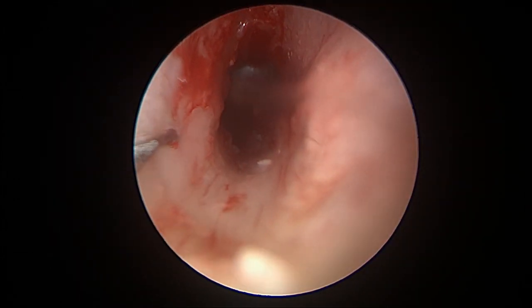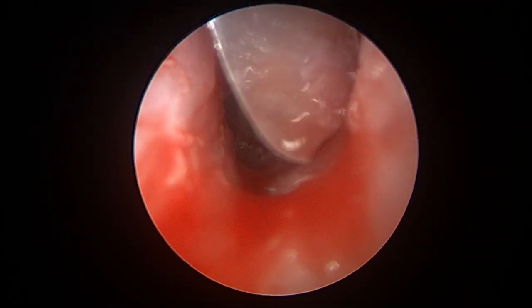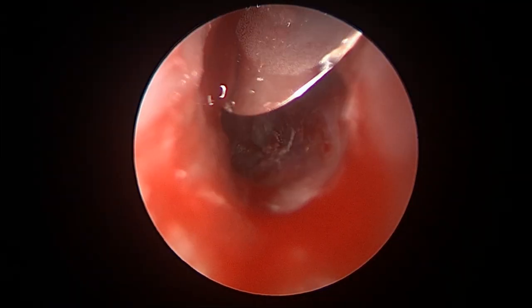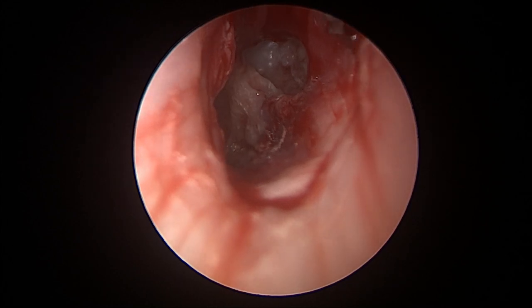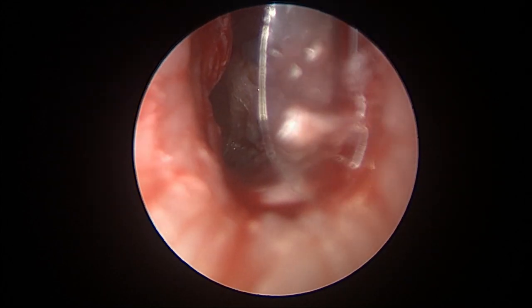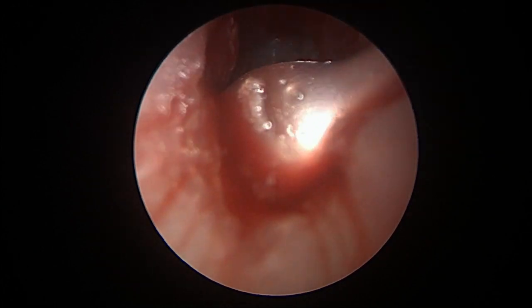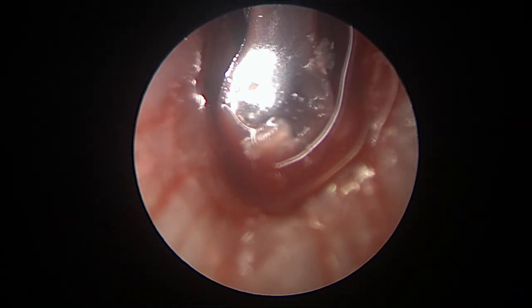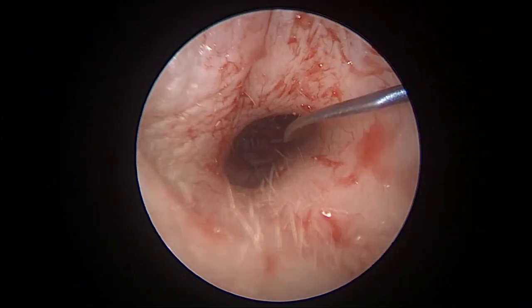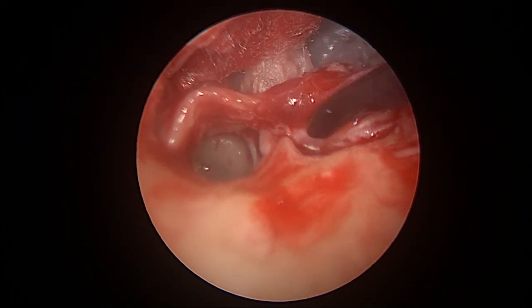Using the same principle of elevation of the tympanomeatal flap with a disposable tympanoplasty knife to elevate the tympanomeatal flap, and starting to remove the cholesteatoma sac transcanal.